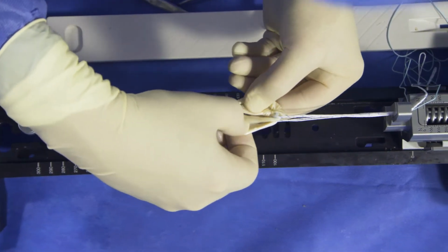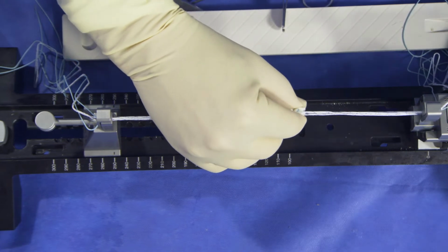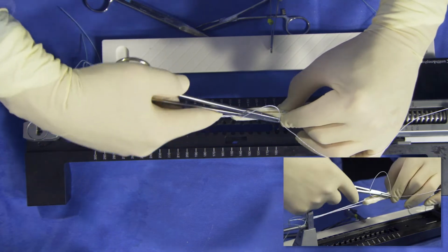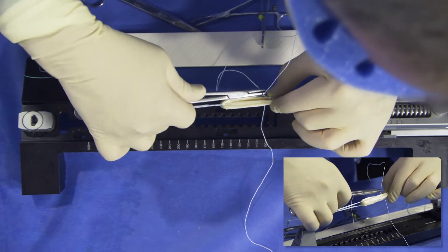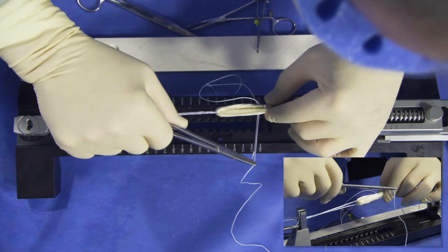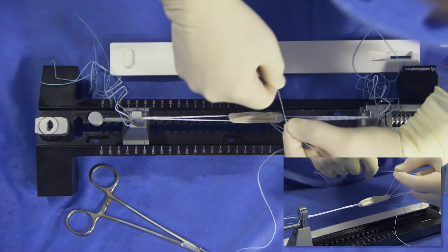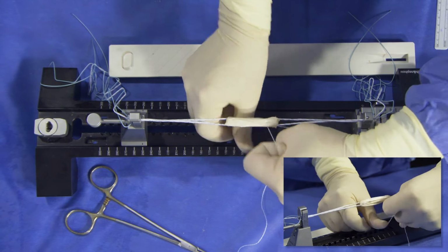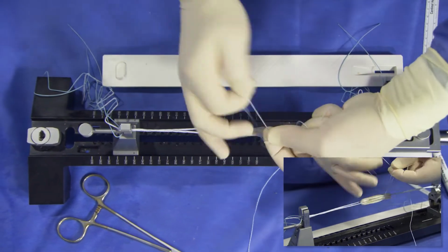We then move the sutured area to the end adjacent to the loop of the ultra button. The tendon strands are sewn to each other with multiple crossing sutures in the exact same fashion as the standard technique. Typically, this is done with four crossing sutures tied with one knot, looped, and then tied again, to secure and package this end of the graft for ultimate implantation into the tibia.